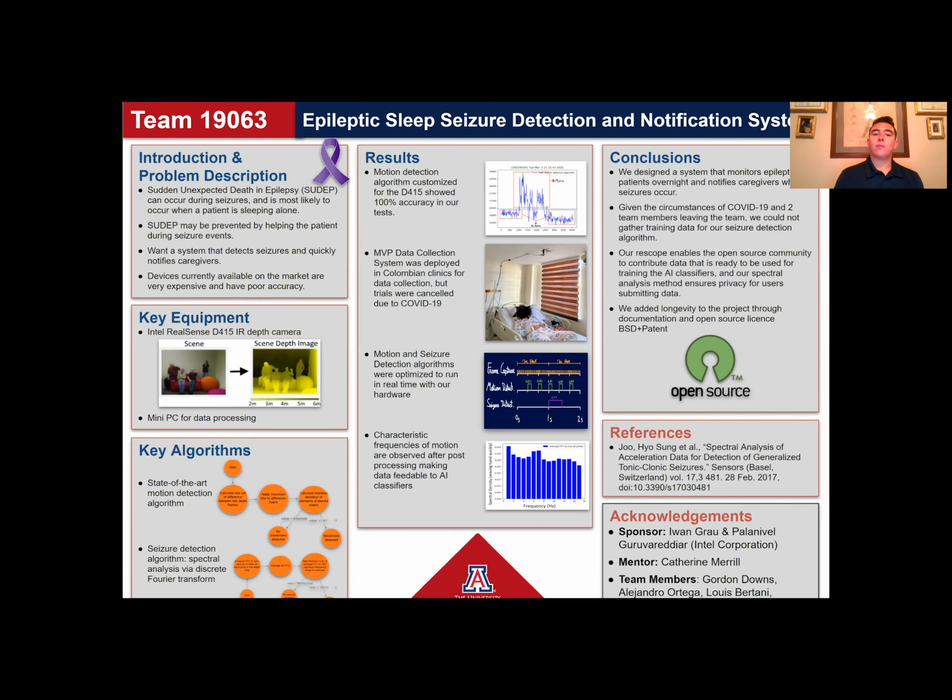We also wanted to analyze videos in real time, so that's at least 30 frames per second given our frame rate. We got 61 and 71 for our two image analysis algorithms, so we passed those tests.